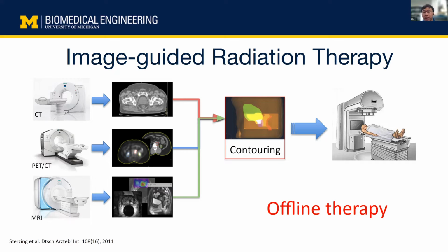There is also some radiation therapy where a radiation source is implanted inside the body, but that's a little bit different. Here we are talking about the radiation generated by the linear accelerator. So those are image-based technologies. Before the treatment, the patient will receive some spatial images like CT, PET, MRI, using this sophisticated image technology to locate the tumor target and also for treatment planning. So during the therapy, the radiation will be delivered as planned.